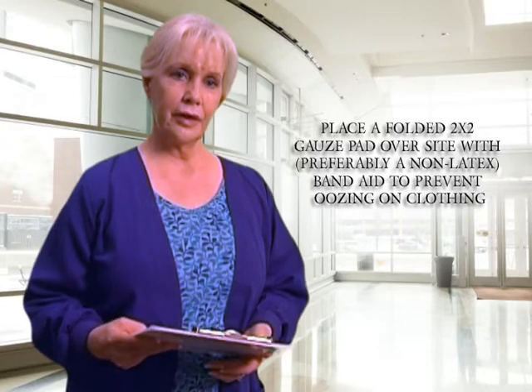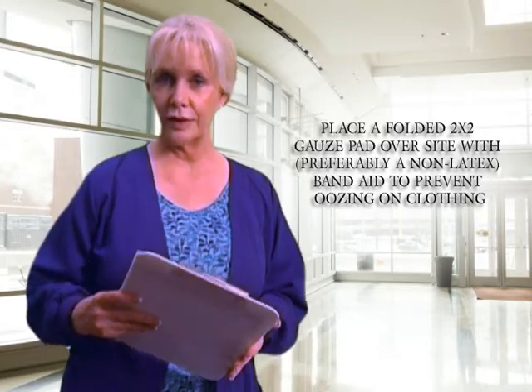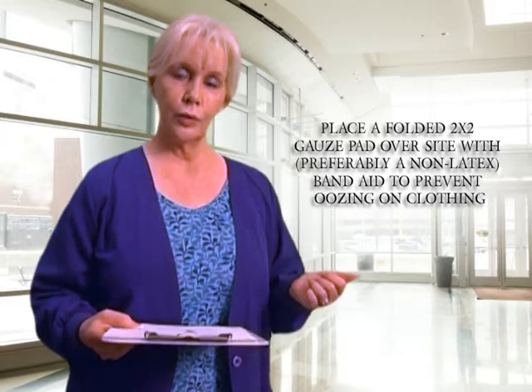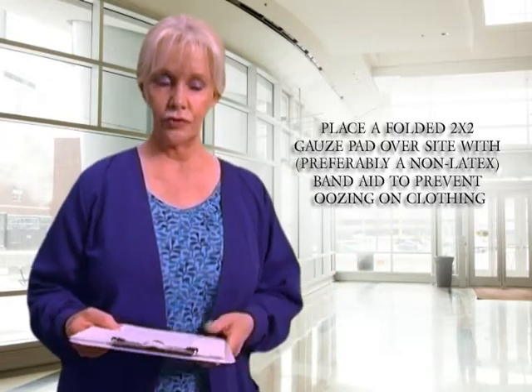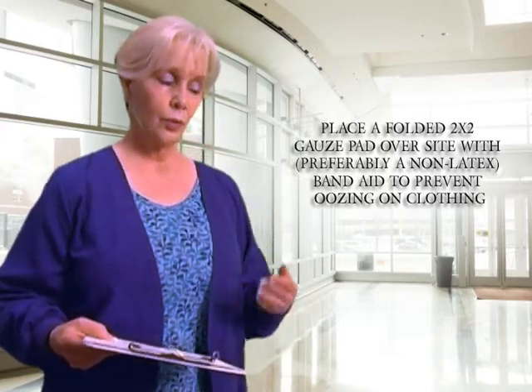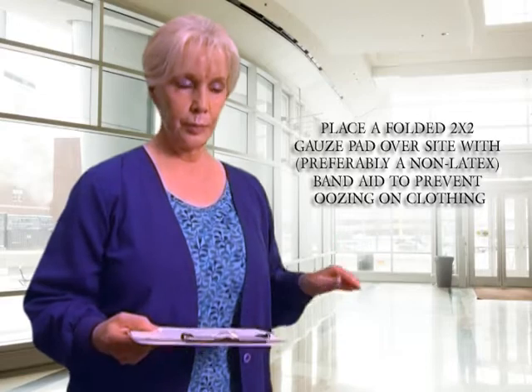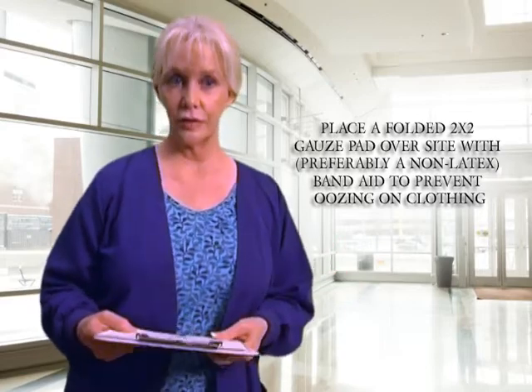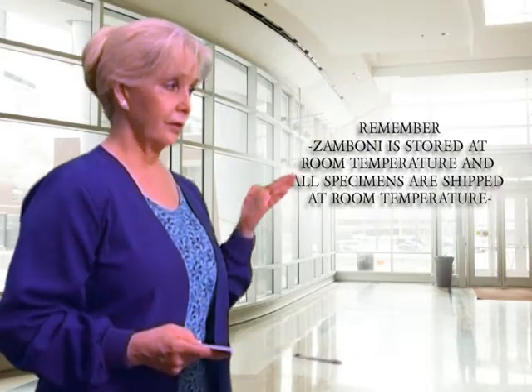Using a little extra pressure on the site, especially if the patient is on any type of antiplatelet or anticoagulant medication, or even holding firm pressure for a minute or so, is always a good idea. We still like to fold up a two-by-two and then apply a non-latex bandage on top of that.